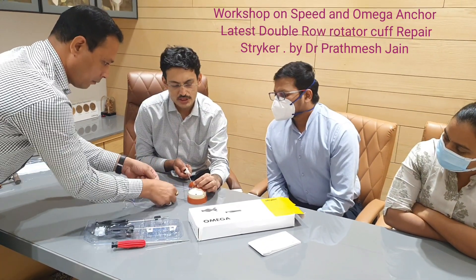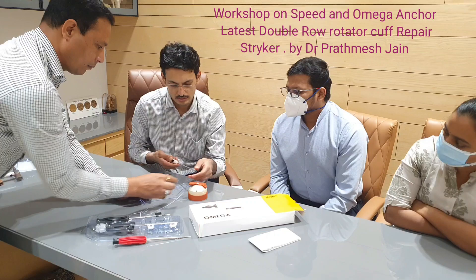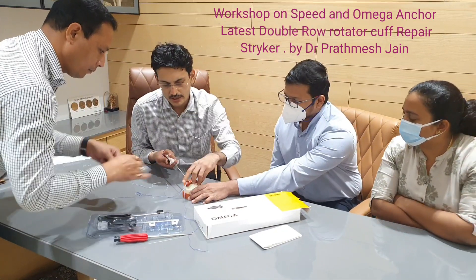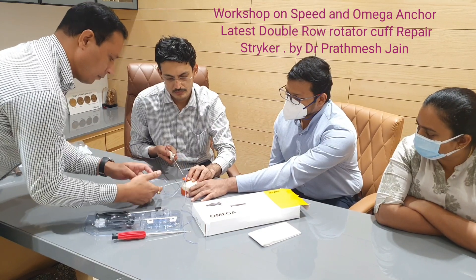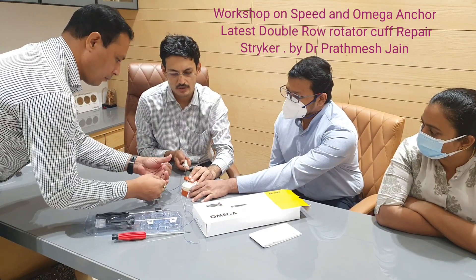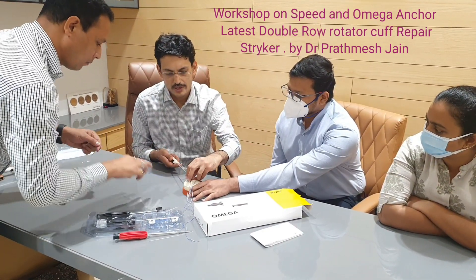We will use one suture at a time — here we are using one suture, take it out, and then use the other suture. We will be passing all four sutures like that from the medial row. You can use two or three on the medial row as desired.